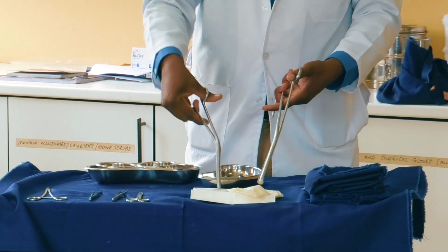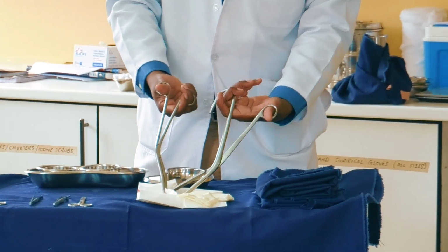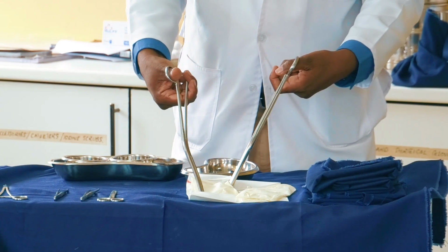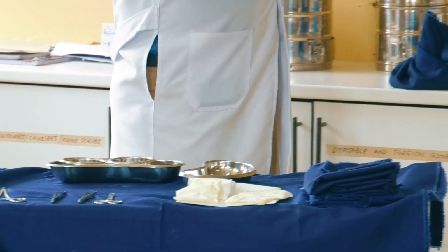You don't have to start touching this part, like we see during OSCE. Just put them on top here. Everything here must be in readiness for use, again, so that it's prepared.